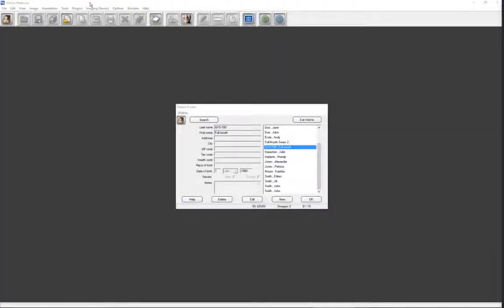Welcome to a Gendex video training series that demonstrates the functionality of Vixwin Platinum 3.5 imaging software. This tutorial will show you how to capture digital images into a predefined mount. Let's open Vixwin by double-clicking on its desktop icon.